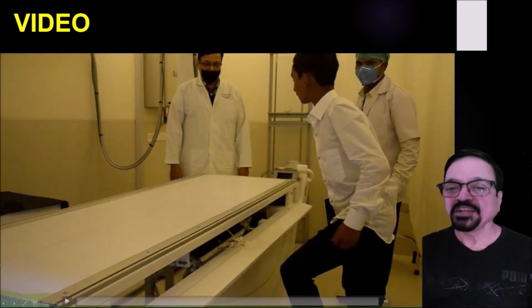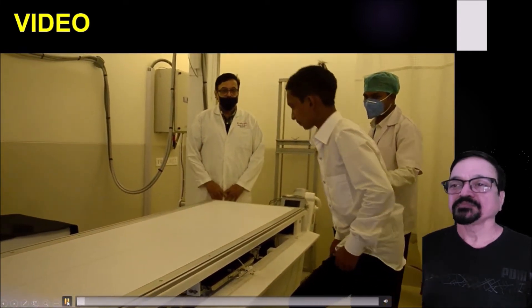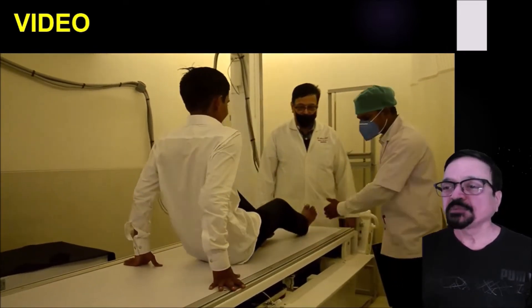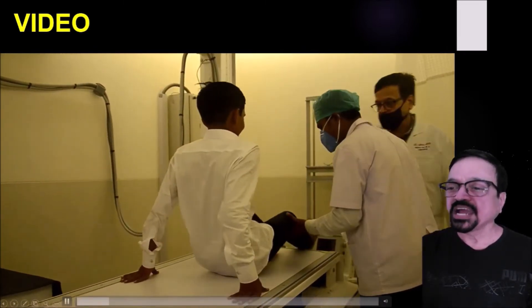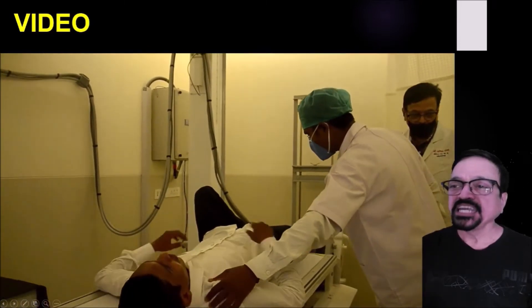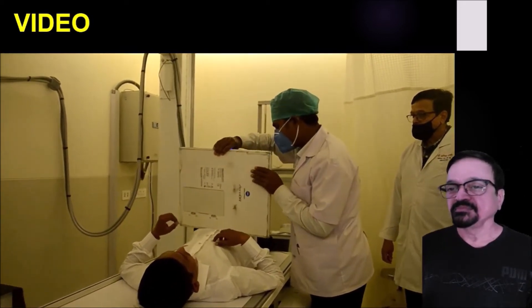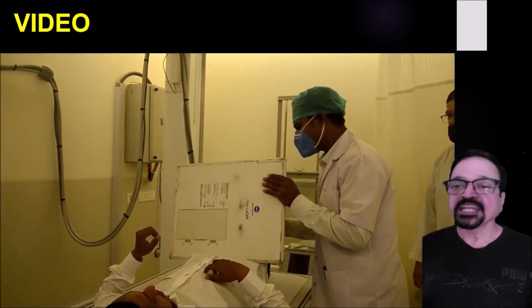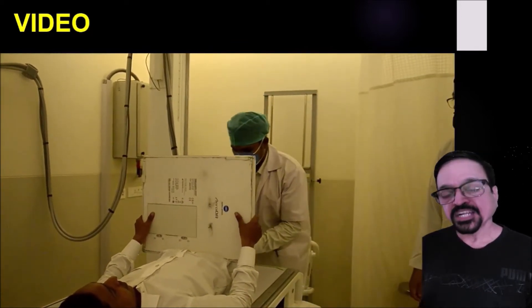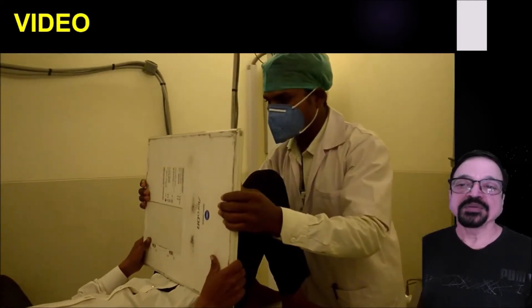Now let's see how this X-ray is taken. First, instructions must be given to the patient as to how to lie down. The technologist must verify whether the position is feasible for the patient, which is the most important thing. If the patient cannot comply — especially in traumatic patients or those with advanced osteoarthritis — then we will have to modify the technique, usually done with the patient in a prone position.